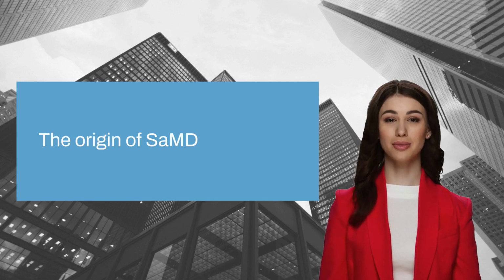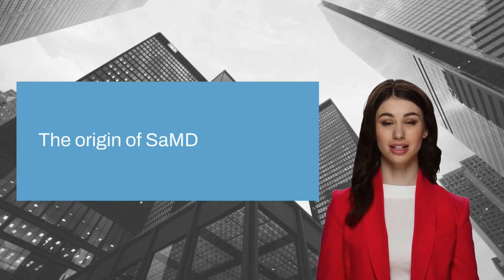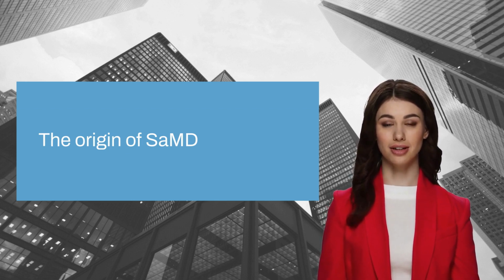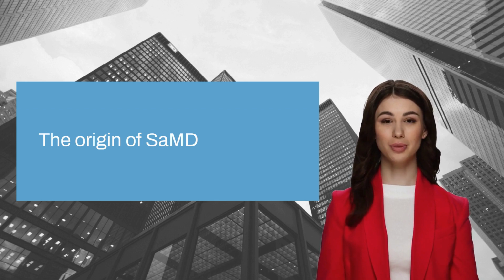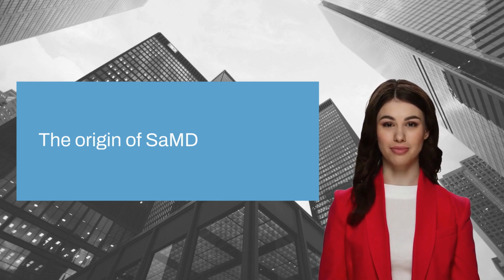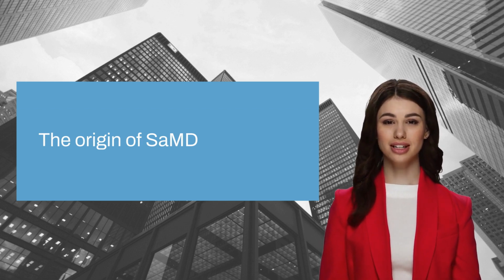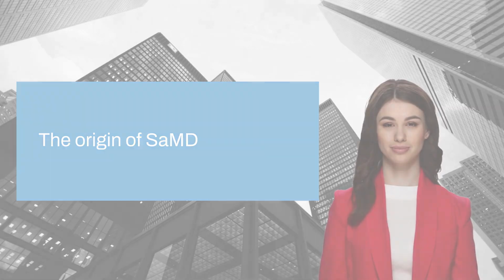HIMSS, Healthcare Information and Management Systems Society, created the term SaMD in 2009. SaMD is a software component of a medical device or system, but it does not meet the criteria of an electronic health record (EHR). SaMD does not collect patient data or provide users access to their own medical information through the app itself. For example, SaMD could be an app that allows users to track their blood pressure over time.